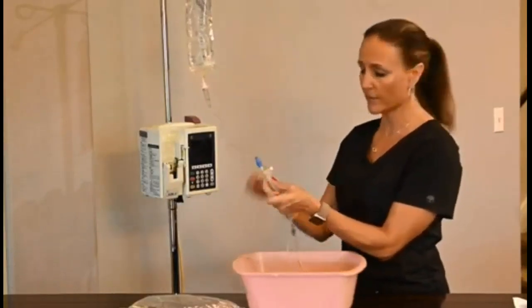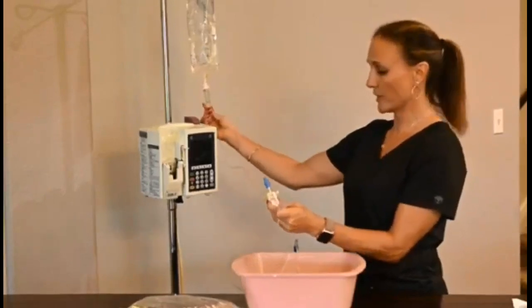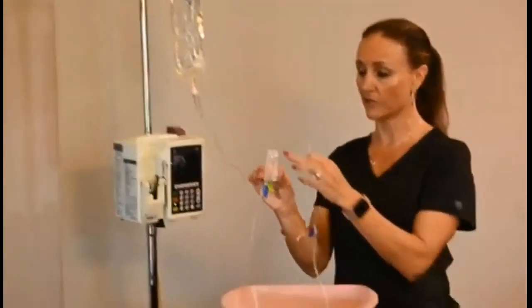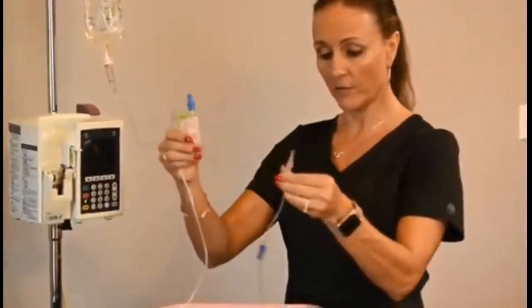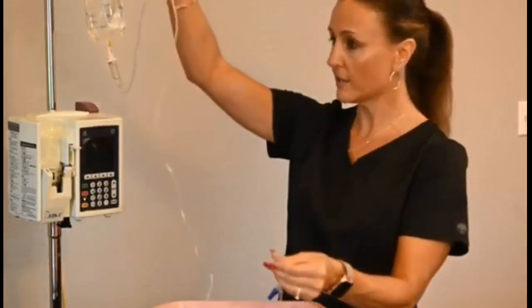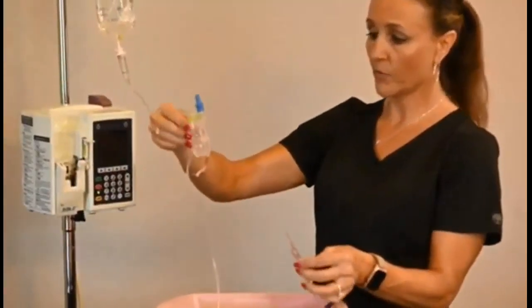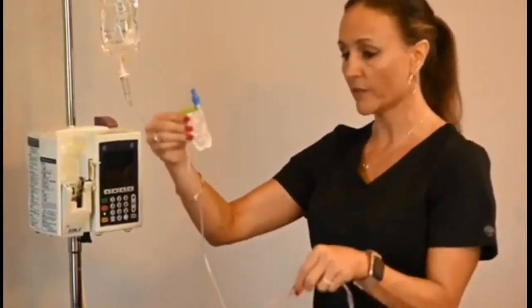I would go ahead and open it, and you would see it dripping, and I'm going to have to put it upside down, and this is what you'll do in lab, upside down until this cartridge fills. Then I'm going to flip the cartridge, and then I'm going to let it go until I see that I've pretty much got all the bubbles out. With brand new tubing, this is going to go very quickly, but because this tubing has been used before, it's going to take a little while.